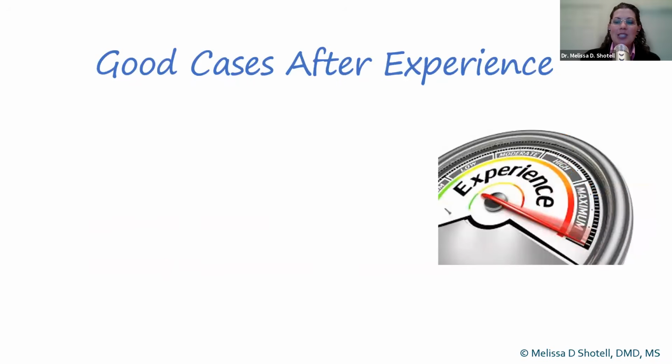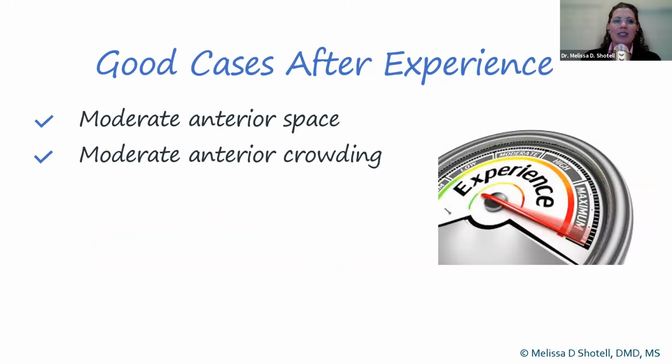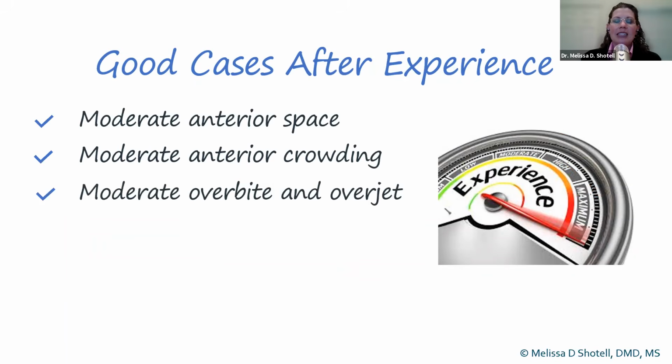Some of the good cases to look for after you've had more experience with in-office clear aligners are any of the moderate anterior crowding or spacing, correction of moderate overbite or overjet, and any class 2 or class 3 corrections.